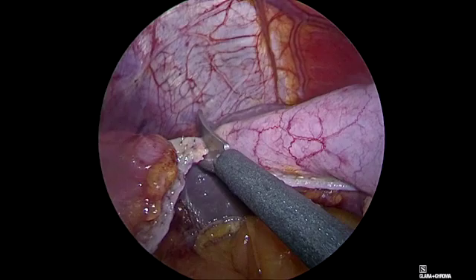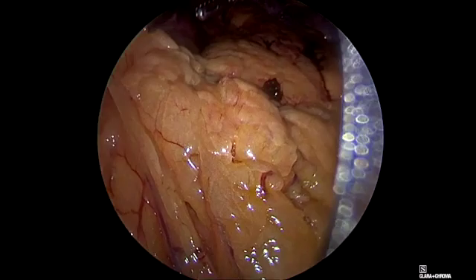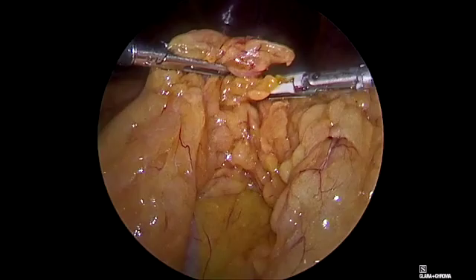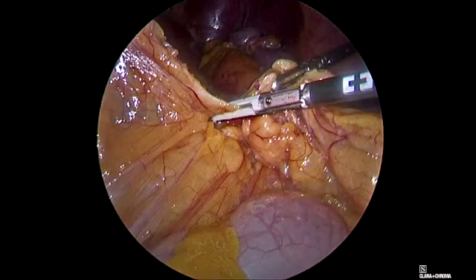Now the right and left hands of the surgeon are using the lower ports so that we can lift and divide the greater omentum. After the division, we can put both sides of the omentum up so that they won't bother us while we are dealing with the small bowel.